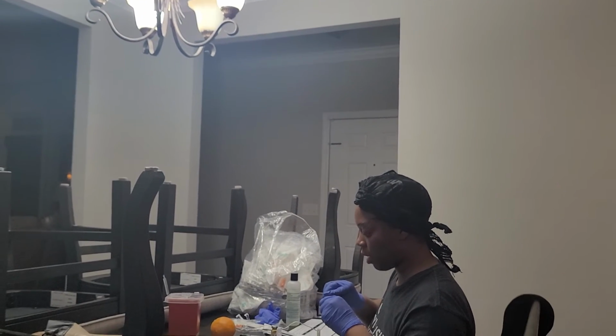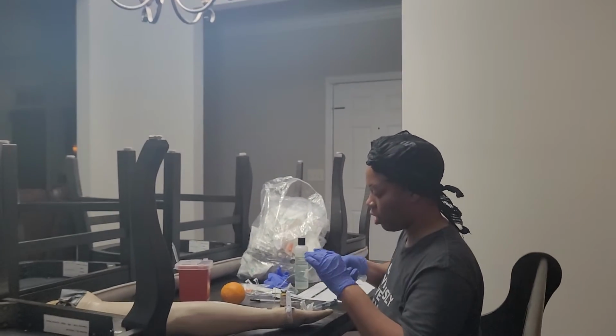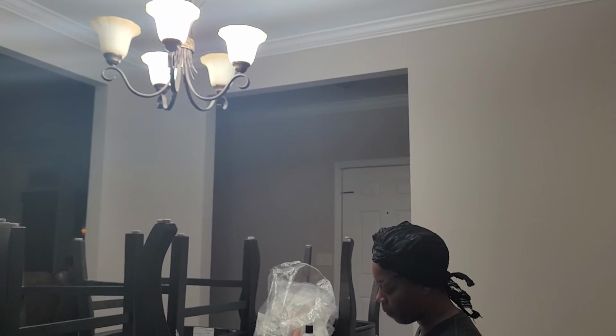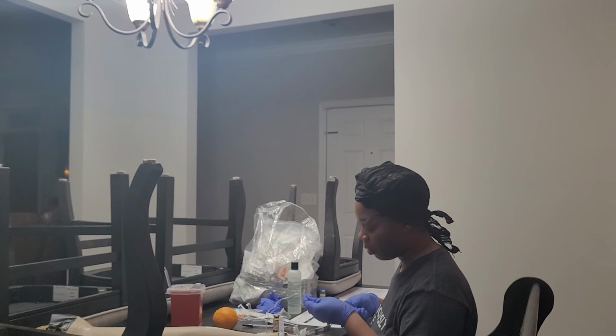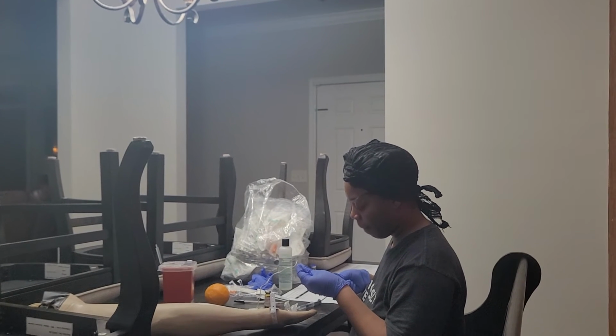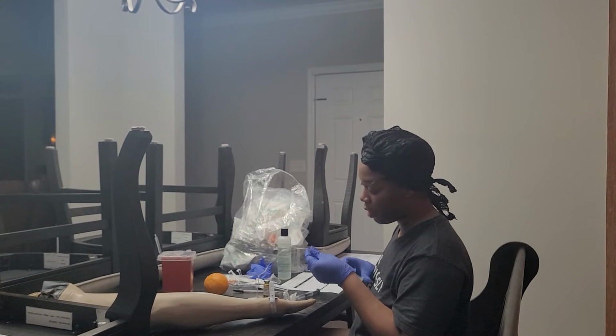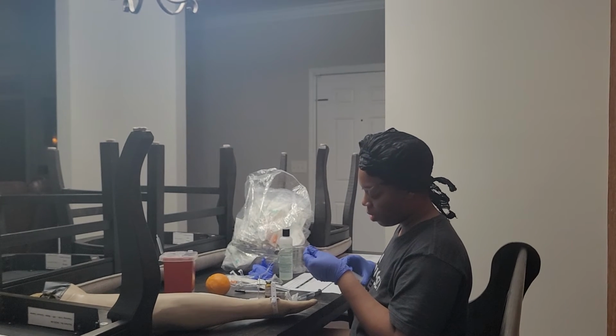This is a Luer lock syringe, a Luer lock extension tubing. So I'm going to draw back a little bit. Make sure I see blood. There is blood return, so we're in the vein.